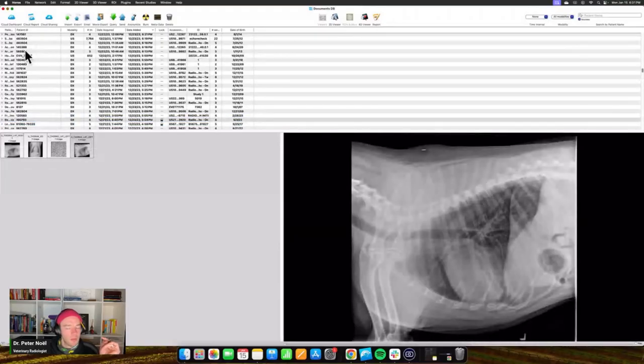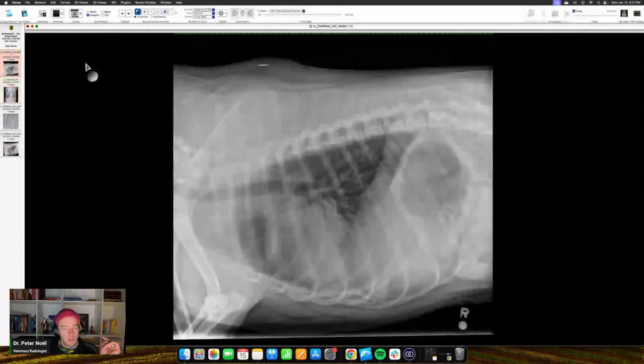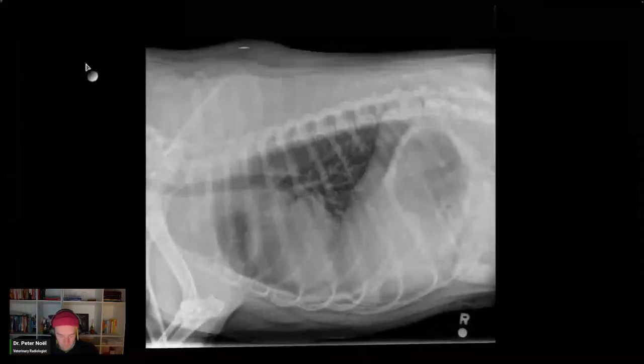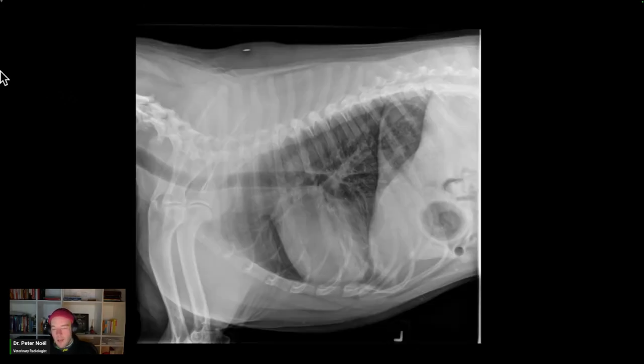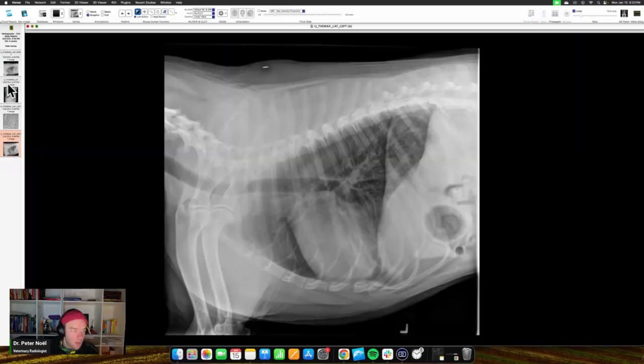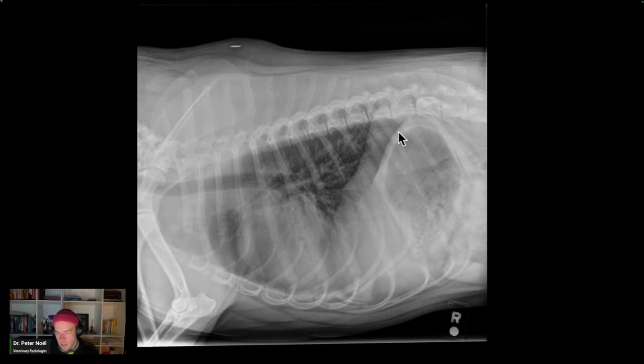Three radiographs. We've got a left lateral view, right lateral view, and a VD view. Okay, I'll give you a couple minutes. Remember, Jerry, 6-year-old golden, coughing. Okay, anybody have anything? Okay, so what we do in this particular case is we say he's obese, he's fat, right? Obese, I guess. We shouldn't fat shame. He's obese. Got a large body habitus. This is a right lateral view because the diaphragm and the crura are parallel, right? He's rotated. See these ribs? They're pretty rotated. So the dog is kind of rolling.